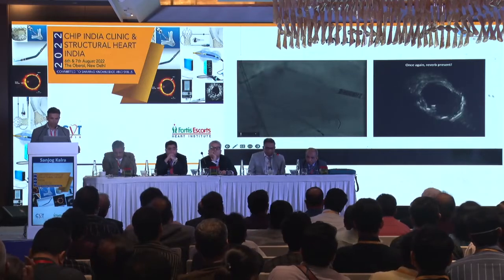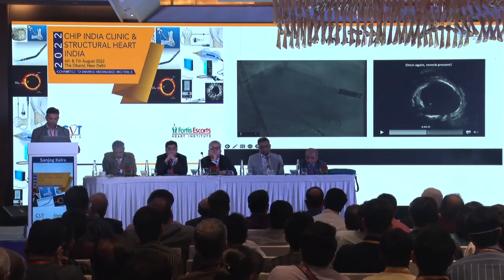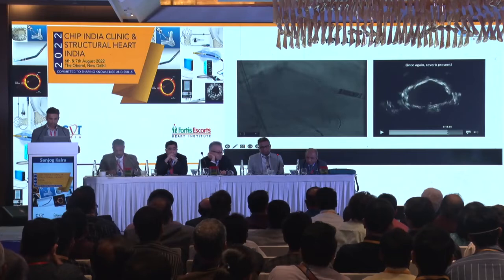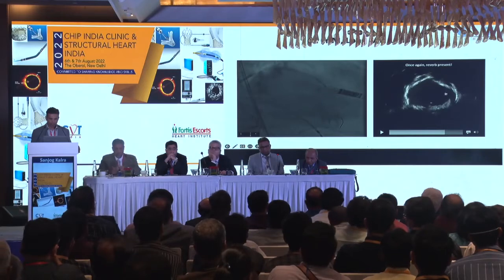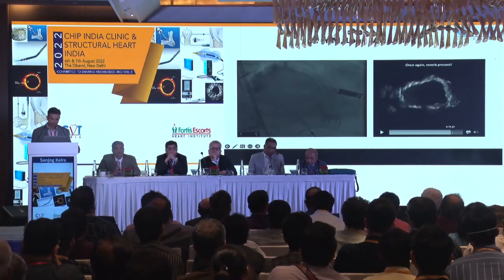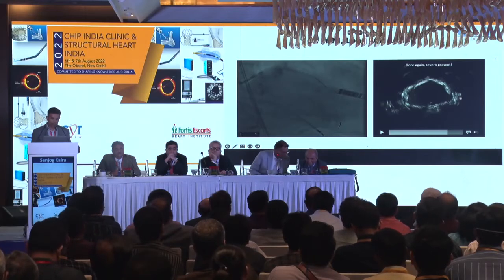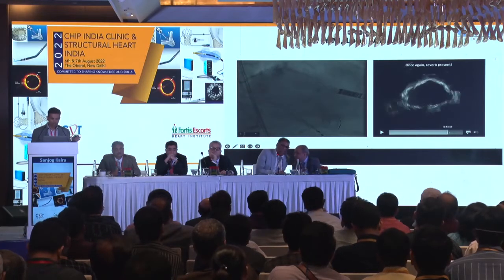And once again, when you look back at the IVUS, what do we learn? We learn that in the IVUS, you can see multiple cracks, right? Okay, and there's reverb here, there's reverb here, there's a crack here, and there's a crack here, right? And even at this very, very tight point, you can still see shadowing and reverberation behind the calcium. So this is, relatively speaking, thinner calcium. This is, not surprisingly then, what a rota cut strategy looks like, where you've got point cuts at the thinnest parts of calcium. So how do we use this information to guide our decision making?